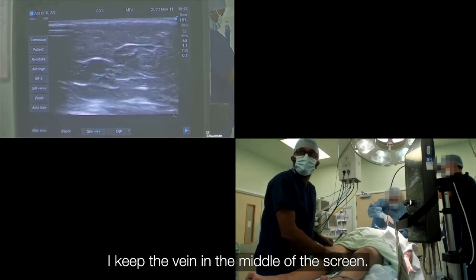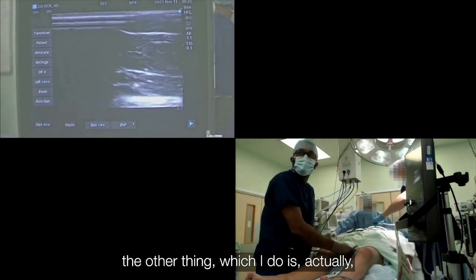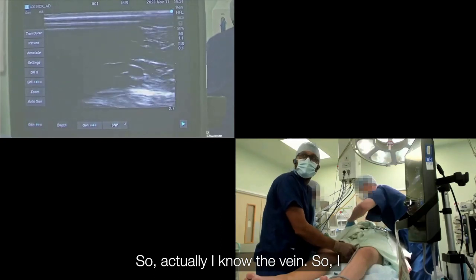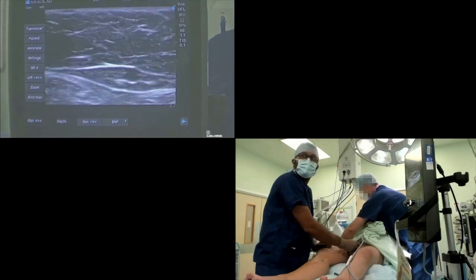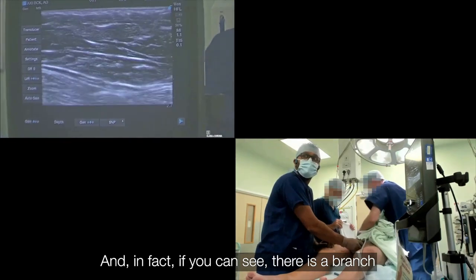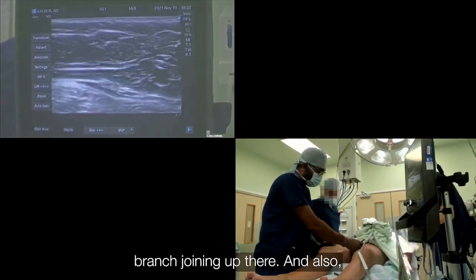I keep the vein in the middle of the screen — it is a very good quality vein. The other thing I do is measure the caliber of the vein. I can still see the vein there, the black dot. I keep going up, and you can see there is a branch joining there on that vein — basically a branch joining up there.